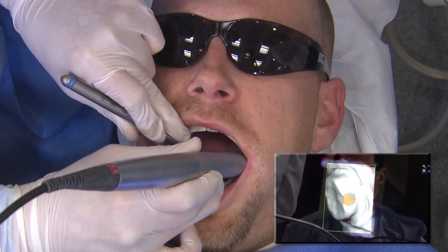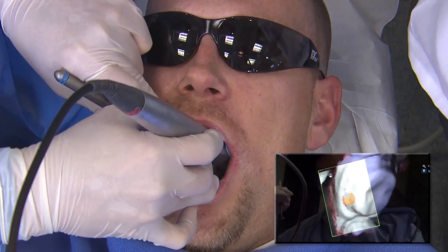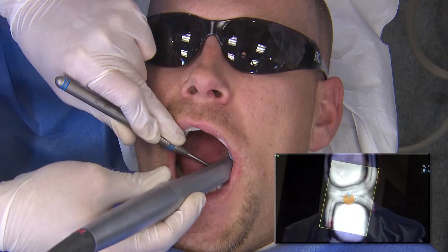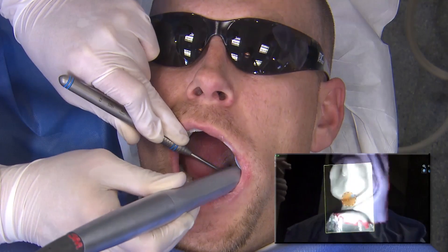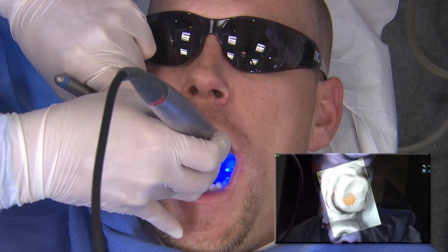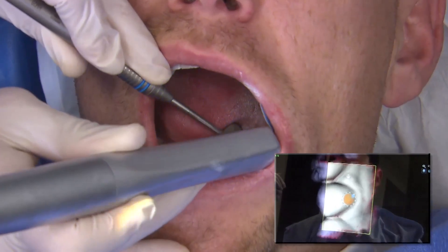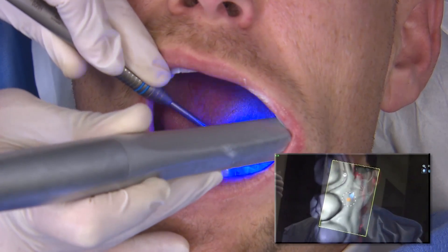I start off with the preparation scans, right over tooth number 18, getting the occlusal areas. I begin my rotations to the buccal and to the lingual. As you can see, the areas are filled in white. Any areas that are missing will appear as a dark area with some pink around that, indicating whether you're missing information. You can just easily go right back over it and sweep over it. The system captures and acquires the information very easily.